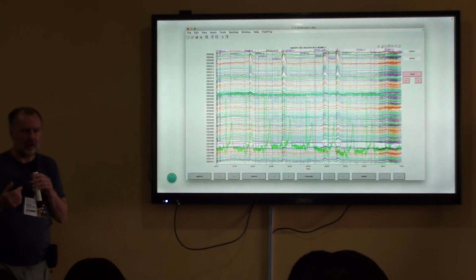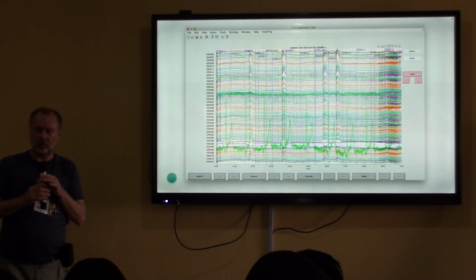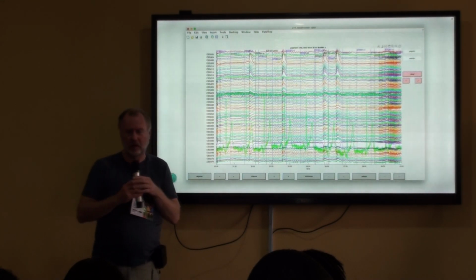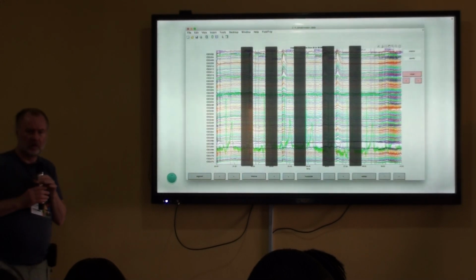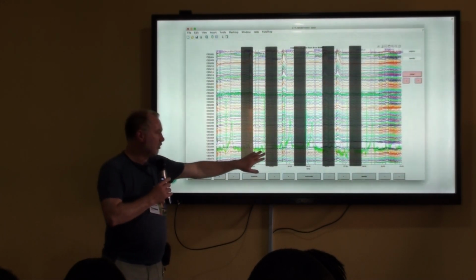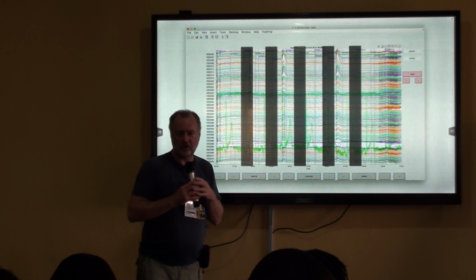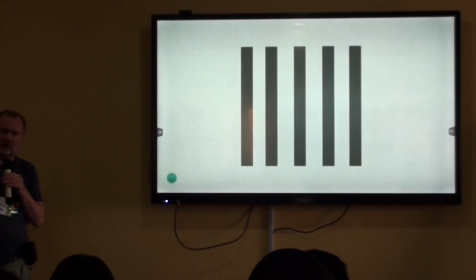So how does this work in slightly more practice? So we have this EEG recording. In this EEG recording, we have triggers. So this is what you've seen yesterday. So we have the triggers indicated here with these vertical lines. And what we do is we cut out trials. So yesterday I've also shown that we cut out these trials, and then we ignore the pieces that are in between the trials. We don't use them. But it's the trials that are precisely timed relative to the stimuli. And that's what we're going to continue with.